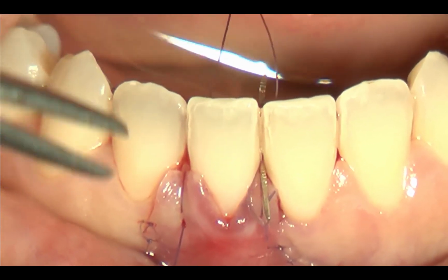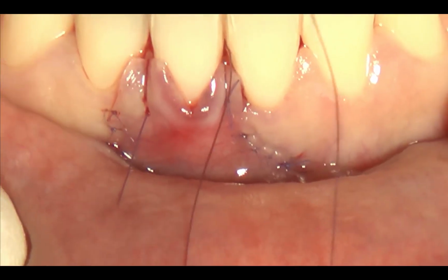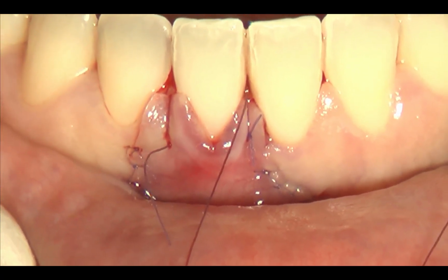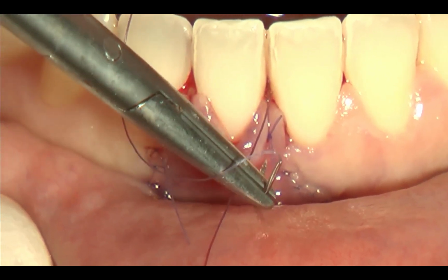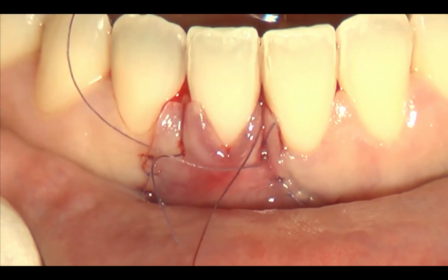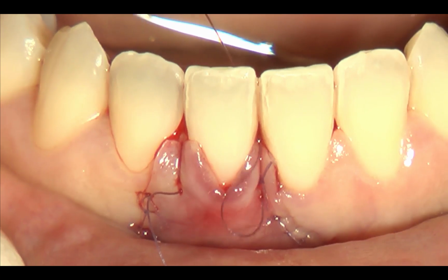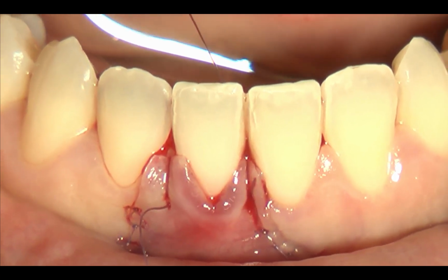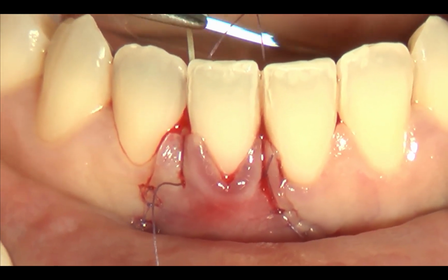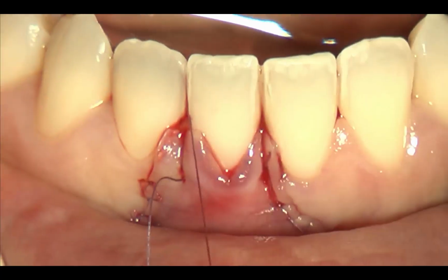Below the contact point at the mesial papilla. Again, surgical anatomic papilla, a bit more apical with respect to the first starting point. Check the compression in the middle. And now, when I close, I have to pull.